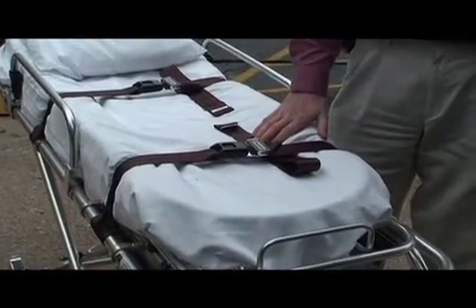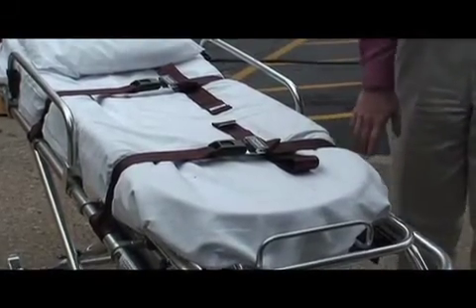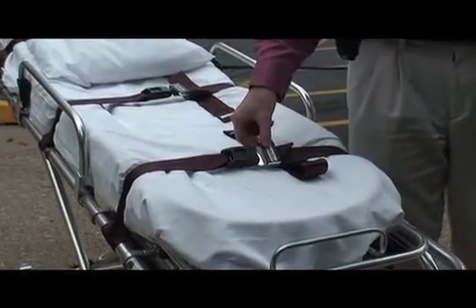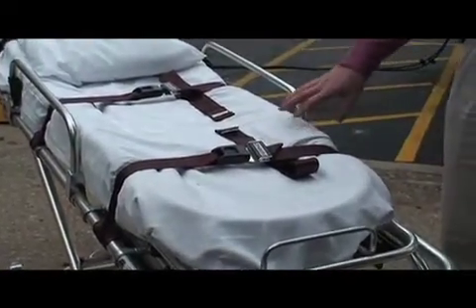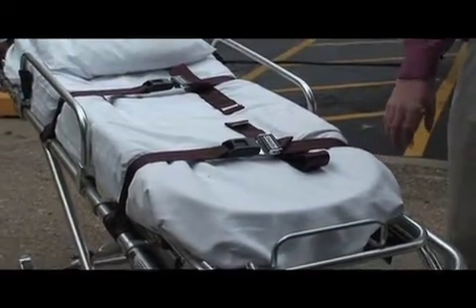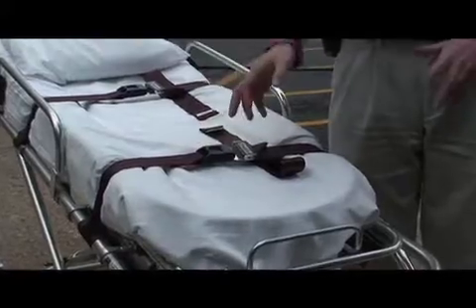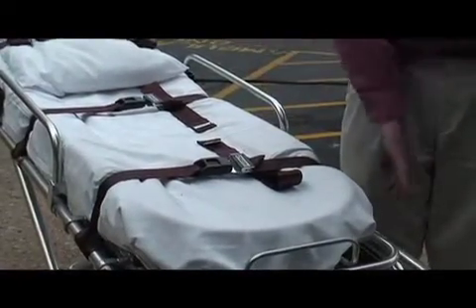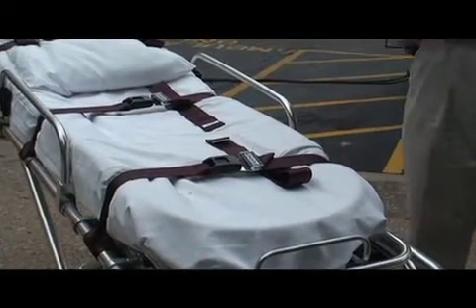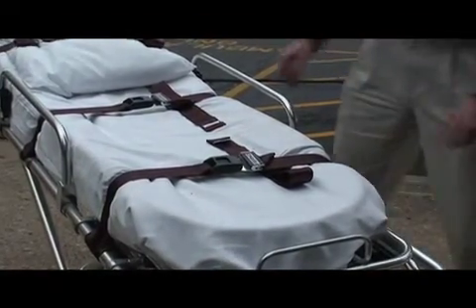It keeps the straps out from under the wheels, which you'll notice over time, the straps get nasty, the plastic pieces will start breaking off, and so forth, and that all happens because the strap ends up on the ground up under the wheels. So even when you have a patient on board, if you can strap it and then tuck the straps so that they don't hang down and get caught in the wheels and the other functional parts of the stretcher that get grease on them and everything else.